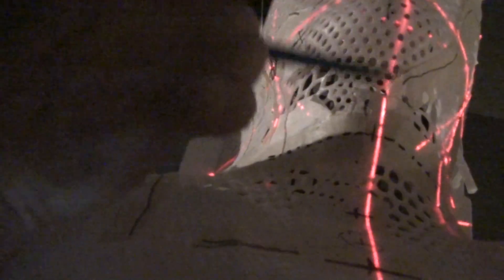So we have the table with the feet of the patient kicked toward the gantry, and it is reducing the angle of incidence because you have a diverging field across here and a flat field here. Now you can go ahead and deliver your treatment.